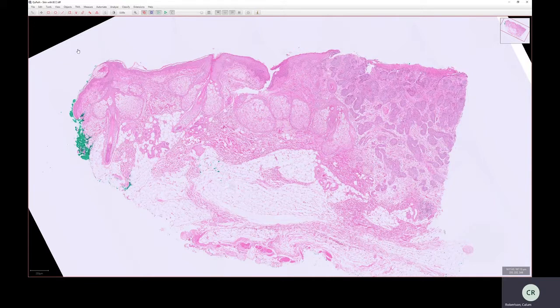And they can be nuclear stains, cytoplasmic stains, or membranous stains. It's outwith the remit of this particular video to go into that. You'll see that when you start looking at diagnostic slides. But suffice it to say, immunohistochemistry, or immuno, or IHC, is the main adjunct test that we use in a variety of different situations. But right now we'll just stick with the H&E.